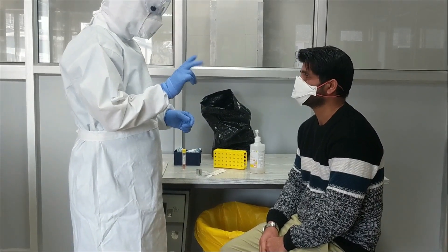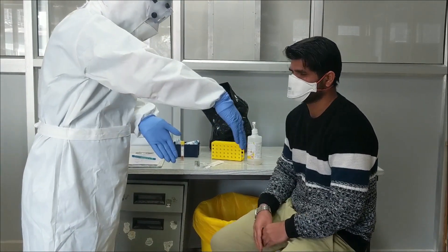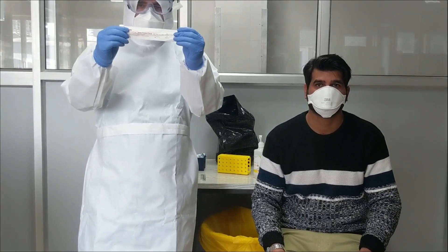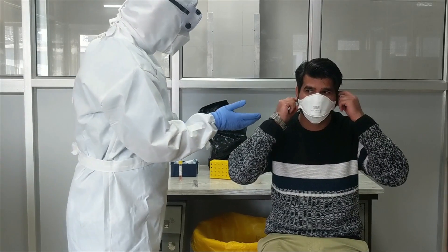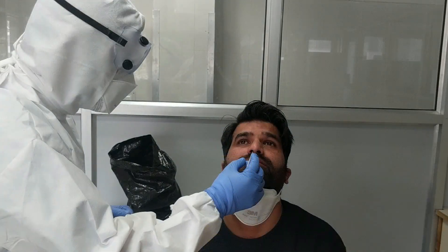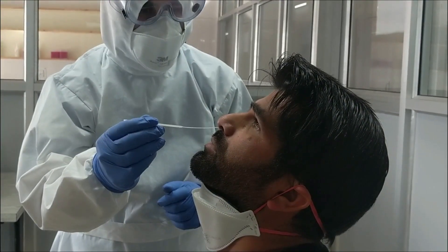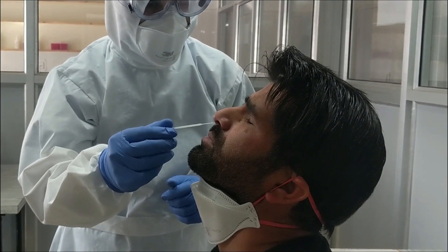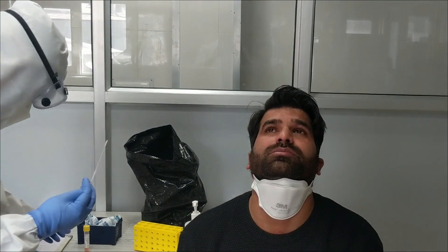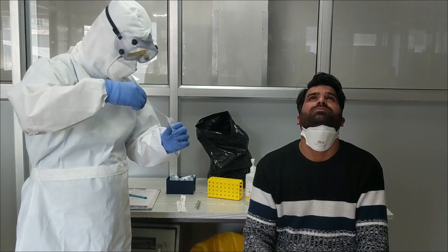For nasopharyngeal swab collection, explain the procedure to the patient. Open the swab package. Tilt the patient's head back to 70 degrees and insert the swab through the nostril to the posterior nasopharynx. Rotate the swab a few times to obtain the infected cells, then slowly remove the swab while rotating it. Transfer the nasal swab into viral transport media as provided.